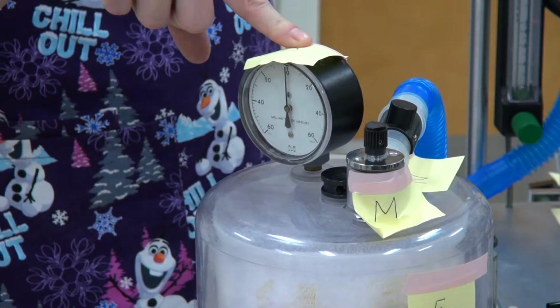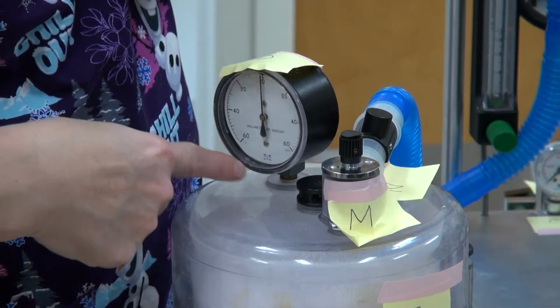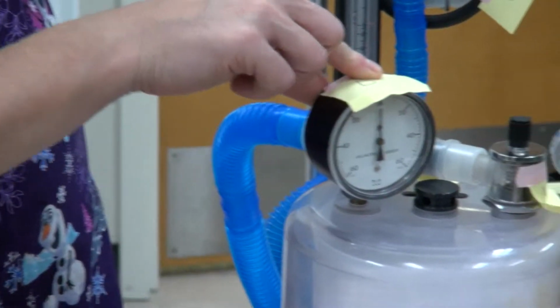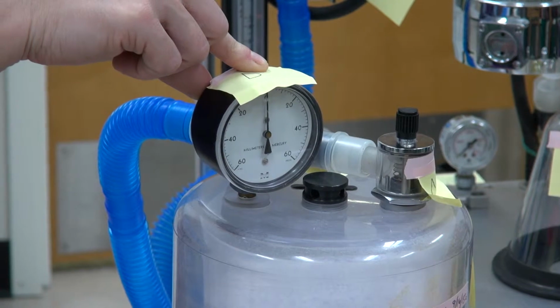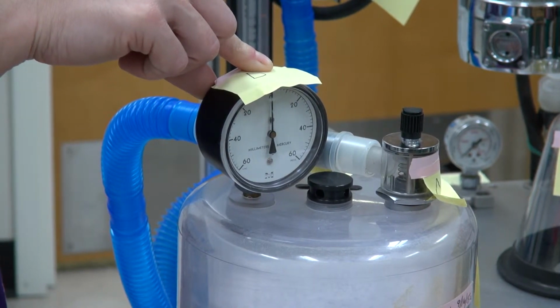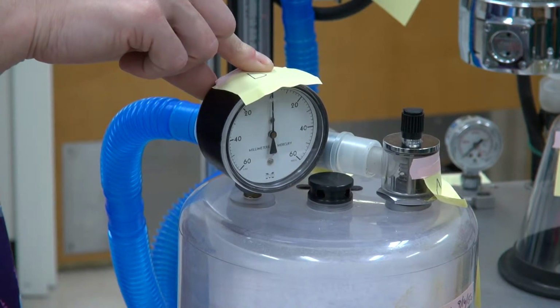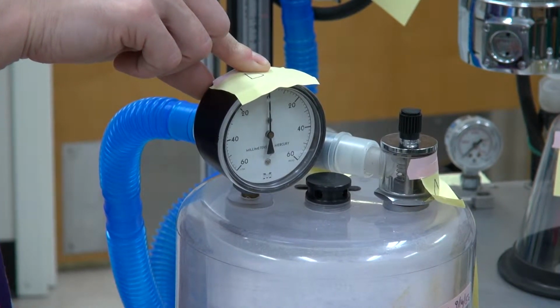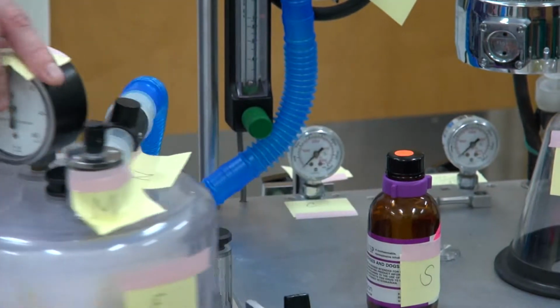That's the manometer, right? This is going to directly measure the pressure that's in our reservoir bag, okay? Manometer, M-A-N-O-M-E-T-E-R. I will tell you guys too, if you go to Quizlet, there's an awesome breakdown of the anesthesia machine, okay? So that's our manometer.